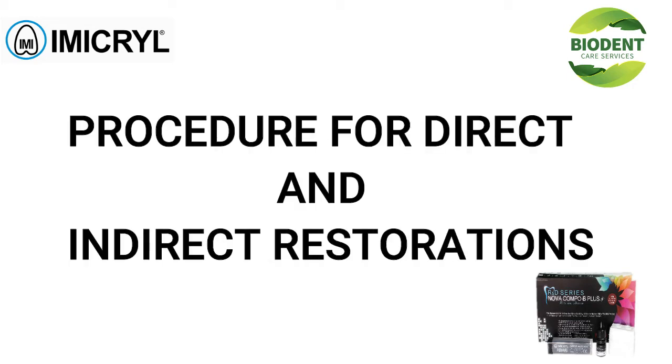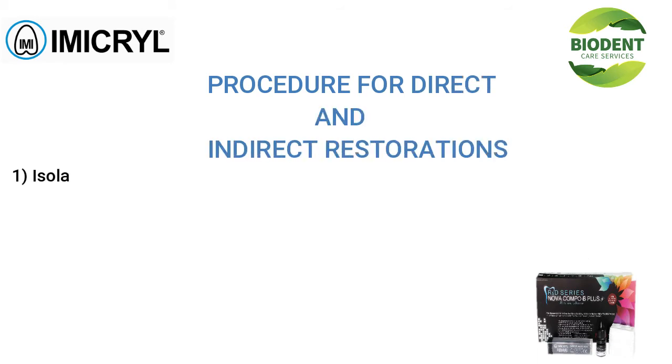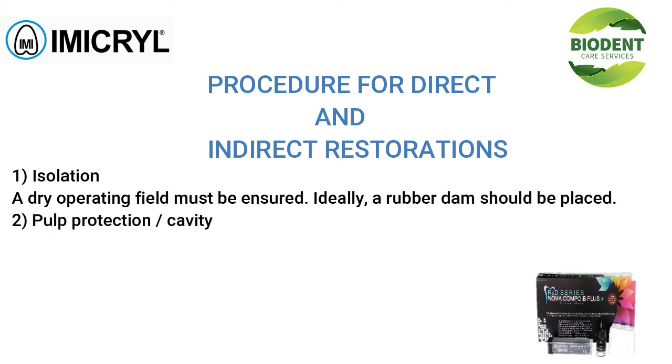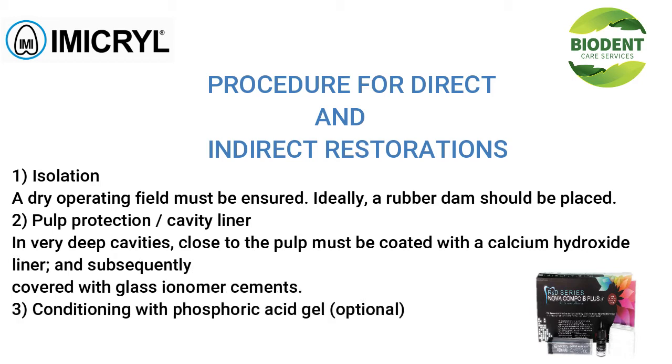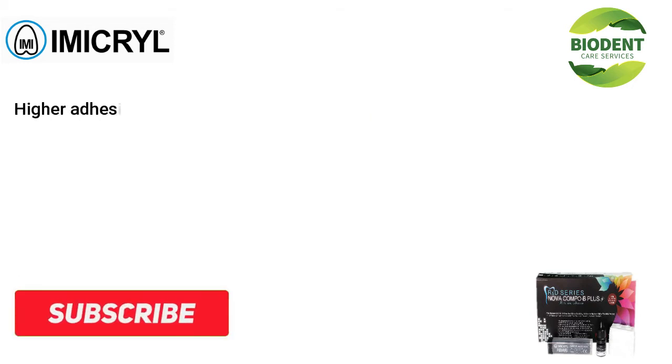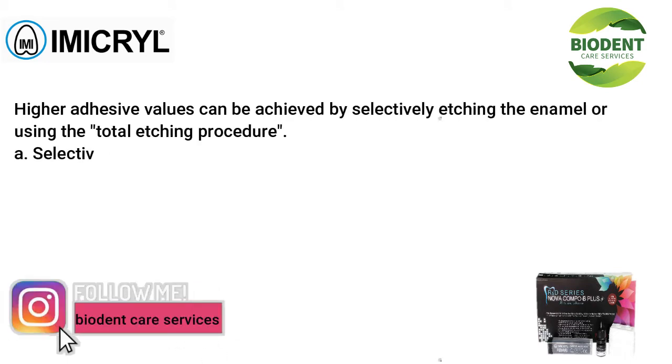Procedure for direct and indirect restorations. 1. Isolation. A dry operating field must be ensured. Ideally, a rubber dam should be placed. 2. Pulp protection, cavity liner. Very deep cavities close to the pulp must be coated with a calcium hydroxide liner, and subsequently covered with glass ionomer cements. 3. Conditioning with phosphoric acid gel, optional. Higher adhesive values can be achieved by selectively etching the enamel or using the total etching procedure.